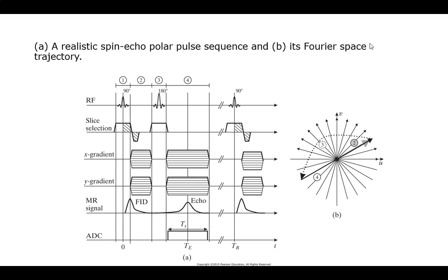Slice selection. Why do I care? Only getting the Z slice, not X. Right. Because I don't get other Z slices, right? Because the other Z slices will cause noise interference. What's going on here? You're moving along your readout line, and so those would have to be the exact same settings they were before. Exactly. It has to be that same ratio.